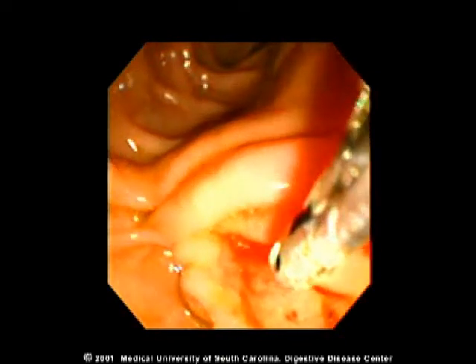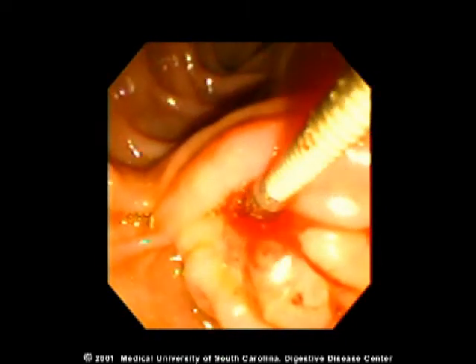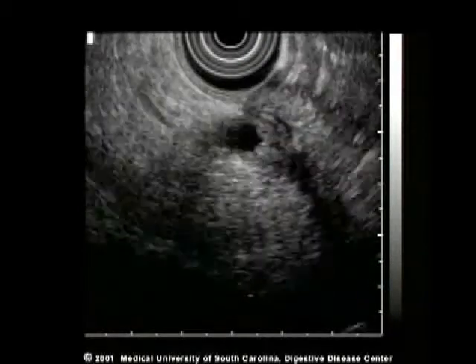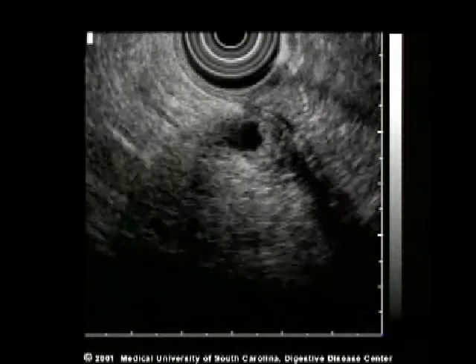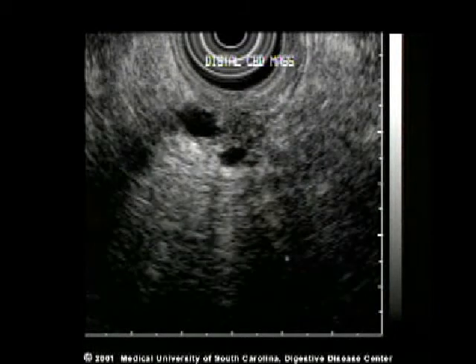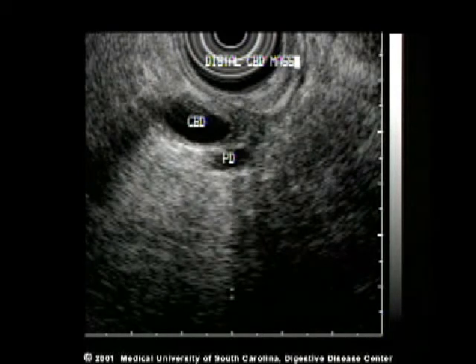The echo endoscope is placed in the duodenal bulb in the normal location for imaging the pancreatic head. By pushing the scope inwards, the distal bile duct and pancreatic duct can be seen. In this case, there is a small tumor in the very distal aspect of the bile duct, which is causing some mild common bile duct dilation.